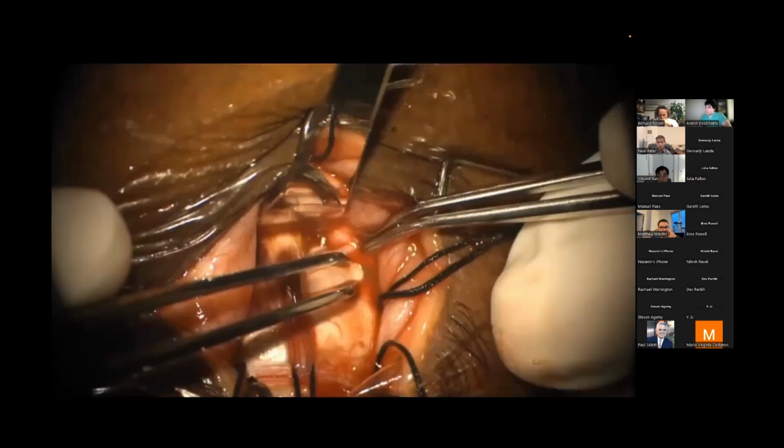And the reason I just want to discuss the vitrectomy, so even if she had, and Matt, he made a good point, the detachment is actually away from the area of the severe retinitis that she had before. But in this case, I feel like after this kind of surgery, she develops inflammation, and it's nice to have vitrectomy and not to have vitreous in the eye, because I do think it will help with less inflammation after the surgery and better recovery.